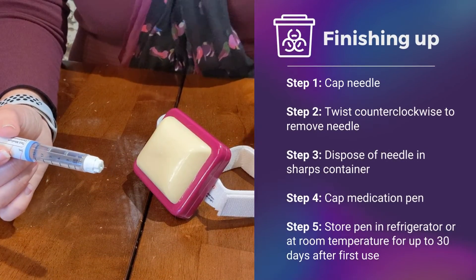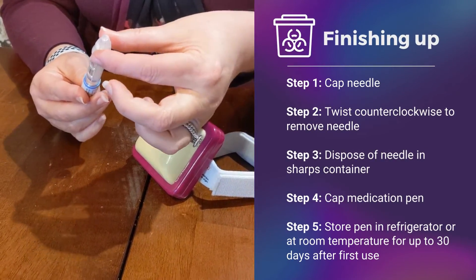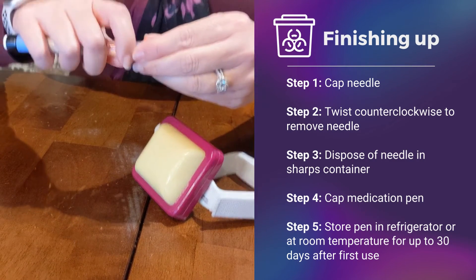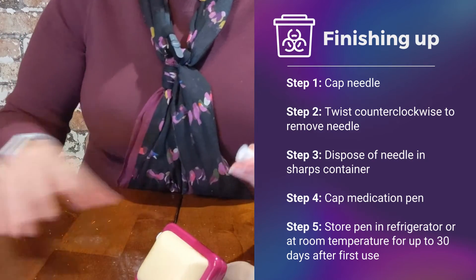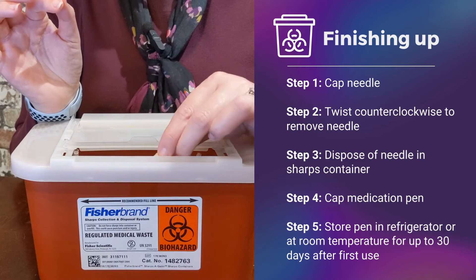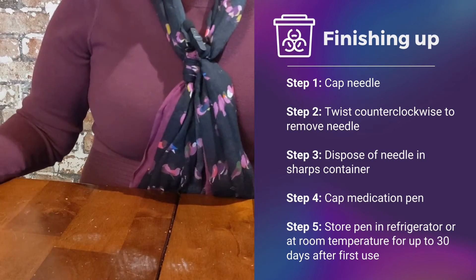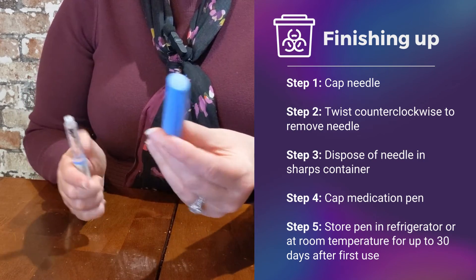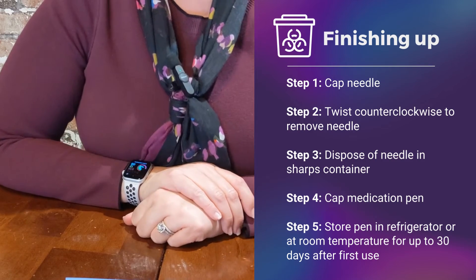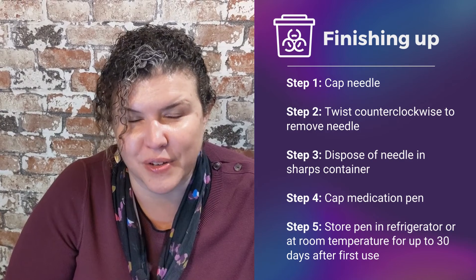Now reach for that outer cap that we talked about, put it on top, and then twist in the opposite direction to remove the needle. Take that needle and put it into your sharps container for proper disposal. At this point, get your pen cap, put it back over the pen, and leave it out for your next day's injection. Thank you so much, and I hope this helps you take your Victoza pen.